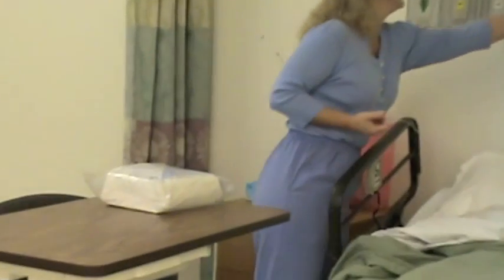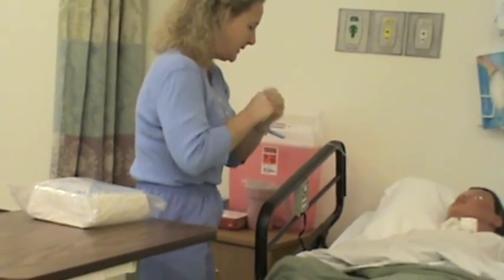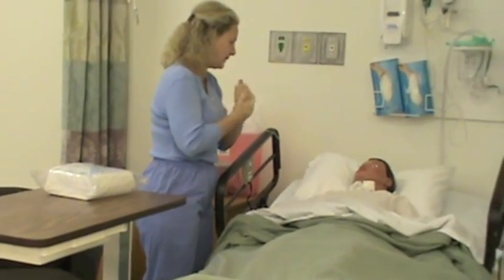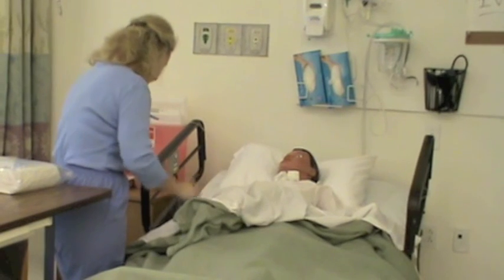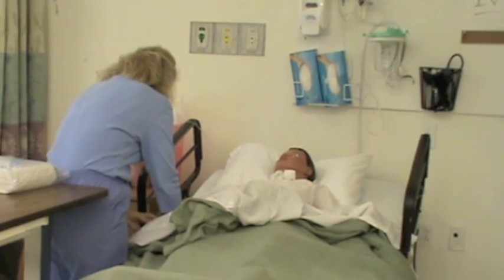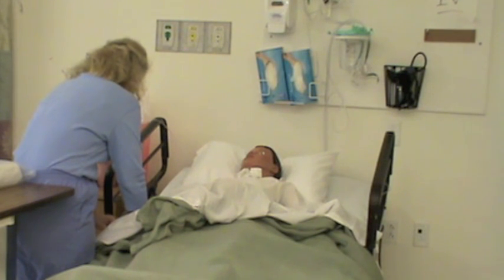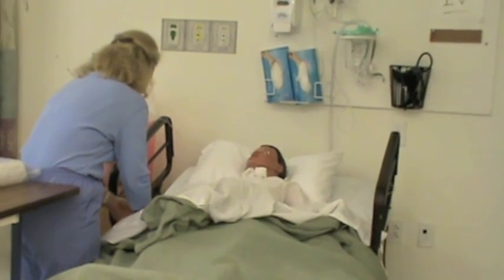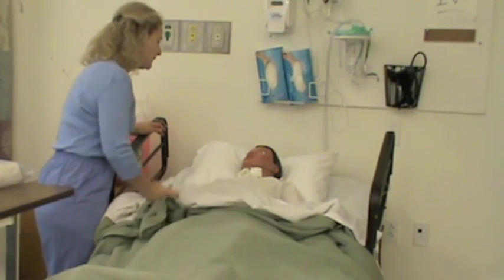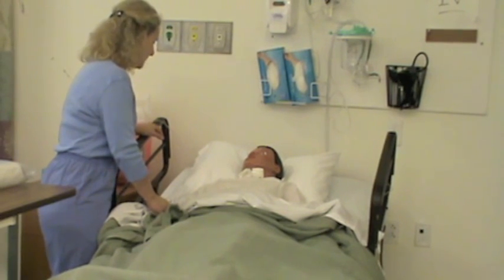I'm going to be your nurse. I'm going to be inserting a Foley catheter. First I want to verify who you are. Can you tell me your name? Morgan Brown. And your date of birth? 8-4-1970. And your medical record number? It's the same as what I have on my label. And can you tell me your allergies? Morphine. Do you have any latex allergies, iodine, shellfish sensitivities, or tape? No, none of those.